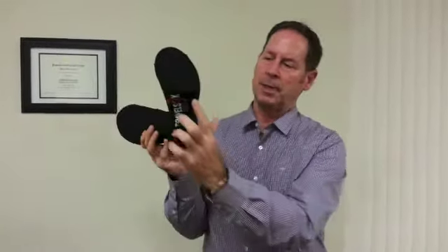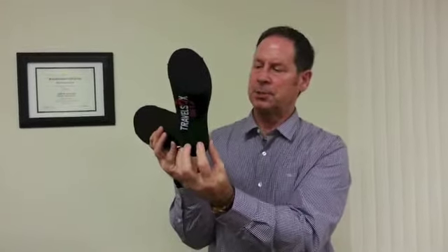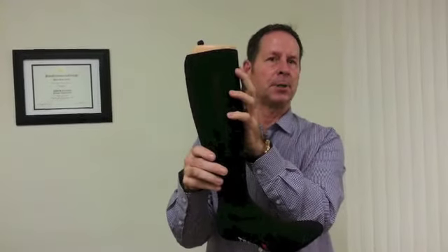On the ball of the foot, that's going to help with plantar fasciitis, any heel or blister issues. On the ankle, that's going to help with shin splints, and Dr. Oz did a feature on varicose veins.